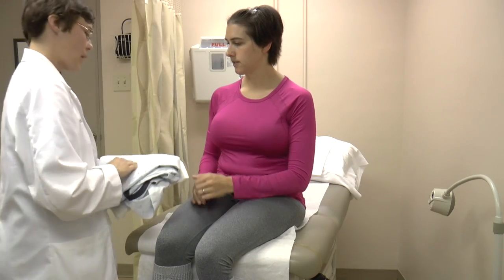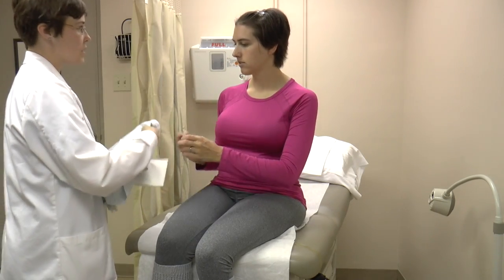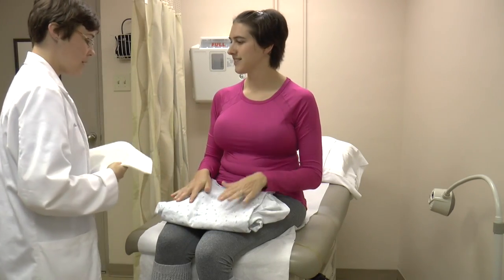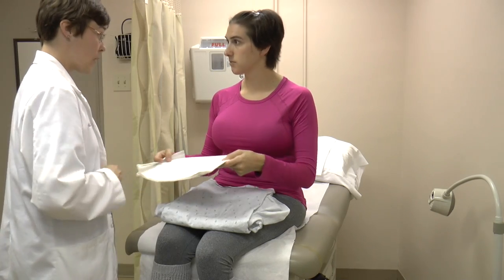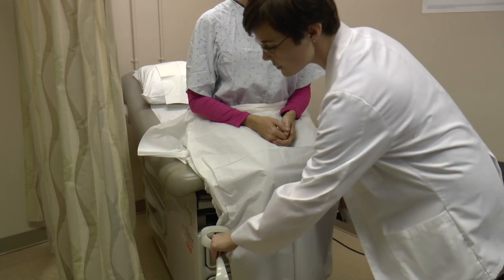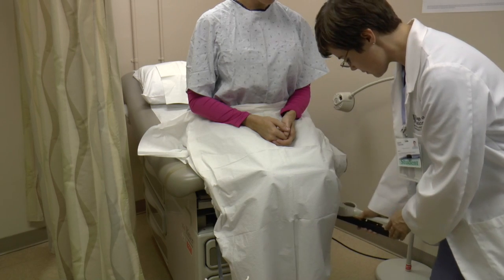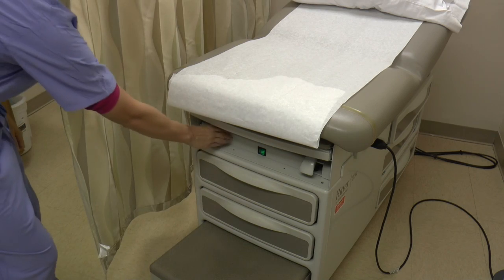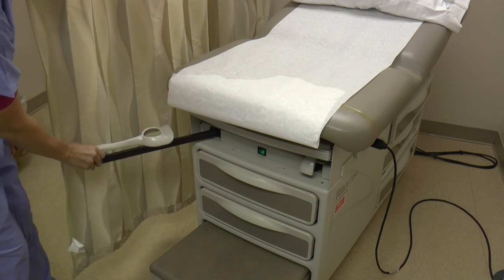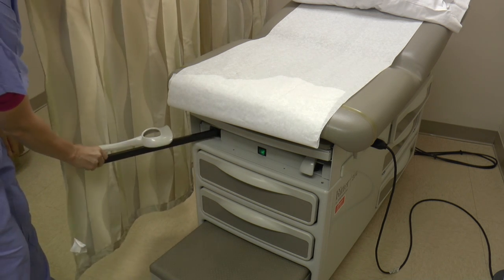At this point in the visit, you should instruct the patient to undress from the waist down, put on the gown, and place the drape over her lap. Excuse yourself from the room while she changes. Preparation is essential so the pelvic exam is smooth and brief. Extend the footrests on the exam table. You should familiarize yourself with the equipment at your particular clinic.